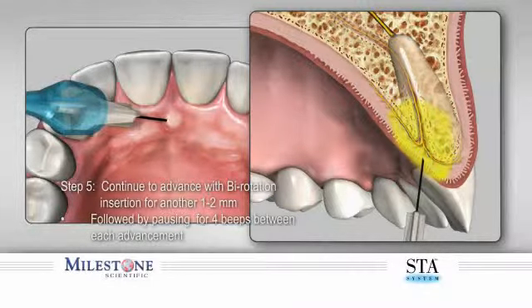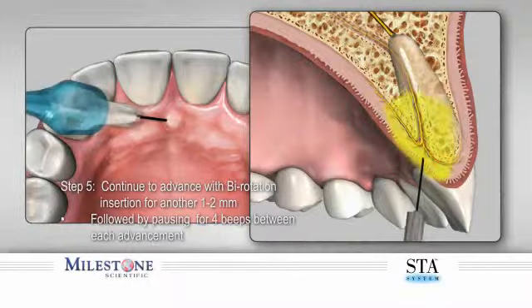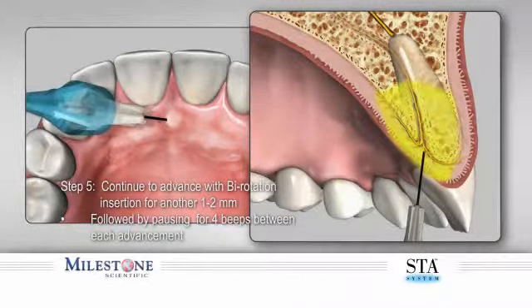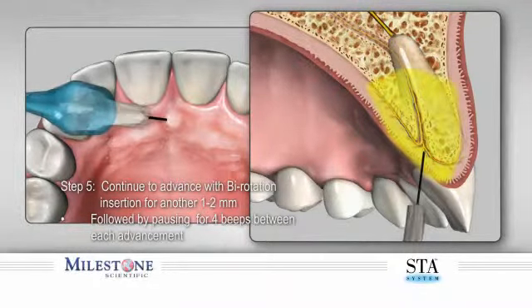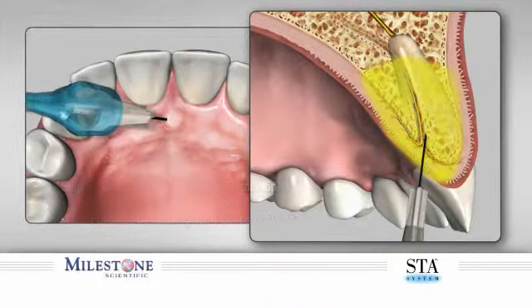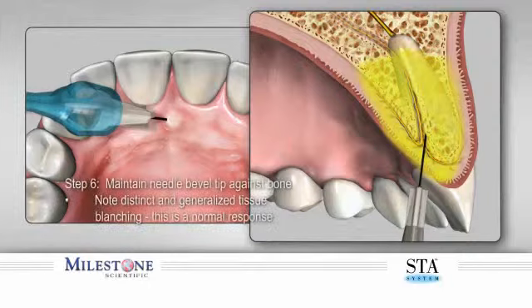Step 5. Continue to very slowly penetrate the palatal tissue with a gentle back and forth movement, while simultaneously advancing another 1 to 2 millimeters before pausing once again. It should take anywhere between 8 to 12 seconds to reach bone, depending on the thickness of the palatal tissue.